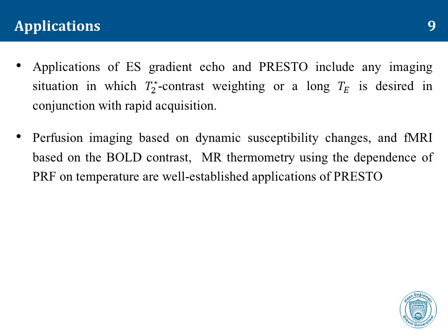Another application of ES pulse sequences is MR thermometry using the dependence of the proton resonance frequency or PRF on temperature. Applications of PRF methods include in vivo temperature monitoring during procedures such as focused ultrasound tissue ablation.